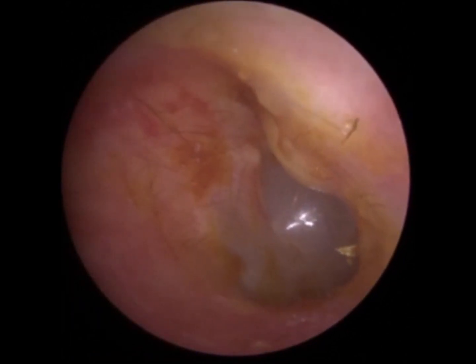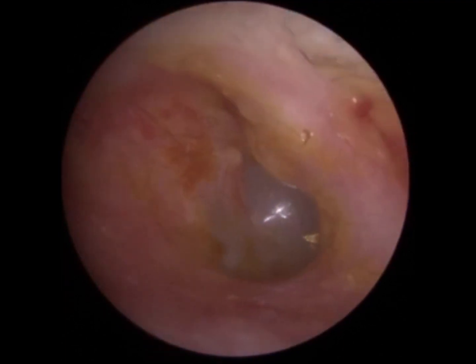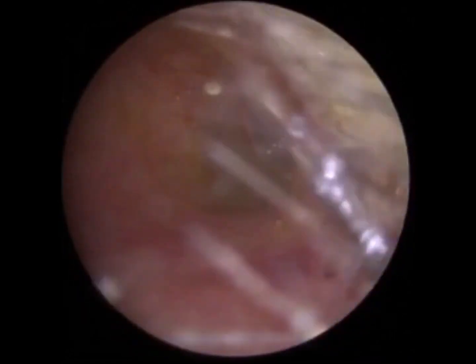There's a bit of swelling near the eardrum on the other side. You should be feeling 100%. How's that for you? Yeah — all the fullness, you know, the horrible feeling is gone. It's horrible, isn't it?